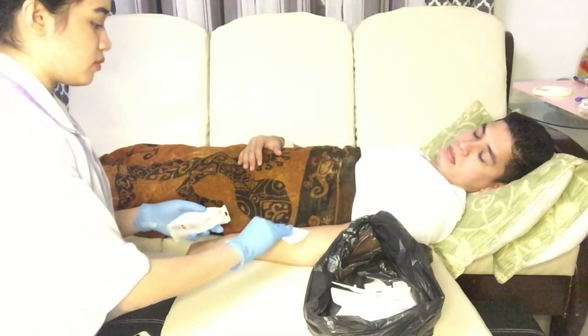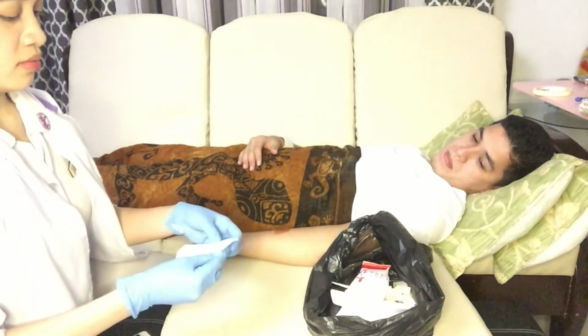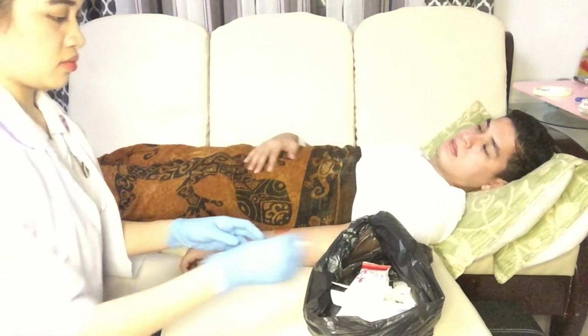Alright. Step 10. Dries wound edges with gauze and dries the patient to reduce moisture and to prevent further bacterial growth. Step 11. Applies appropriate dressing, labels with time, date, and student nurse's initials to provide proper documentation and accountability.